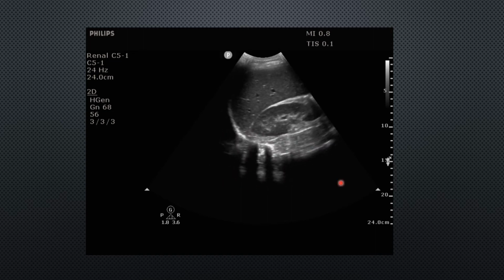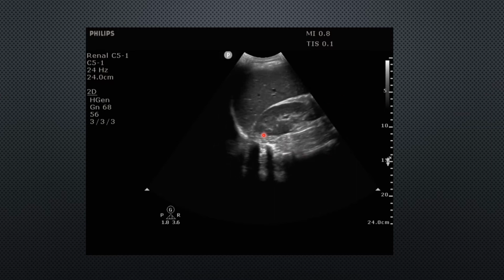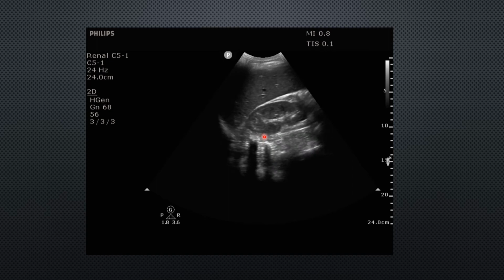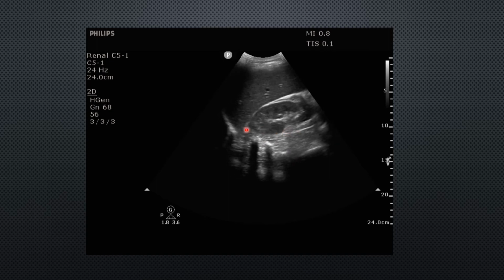That's a general guideline. We'll get a little bit more specific a little bit later on, but that's usually where you want it to be. So this is way up on the upper half of the screen, so it's too high up, and you're going to be losing a lot of detail, and it's a lot easier to miss things when you're doing this.